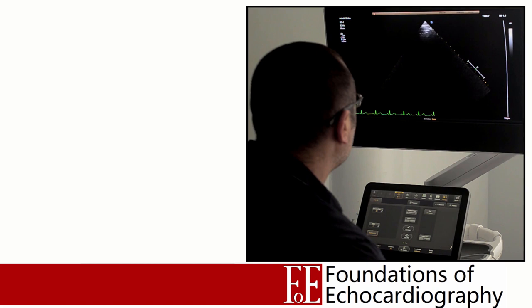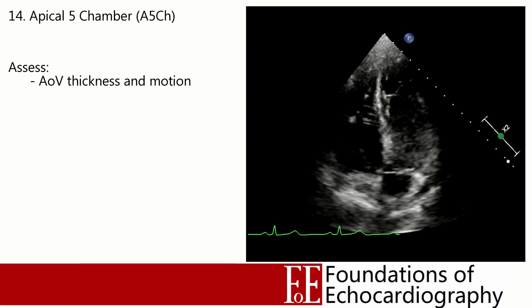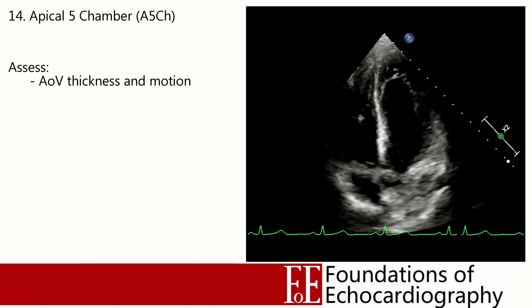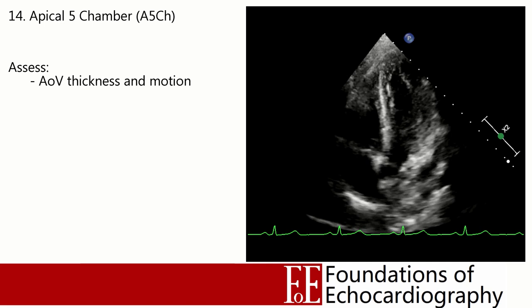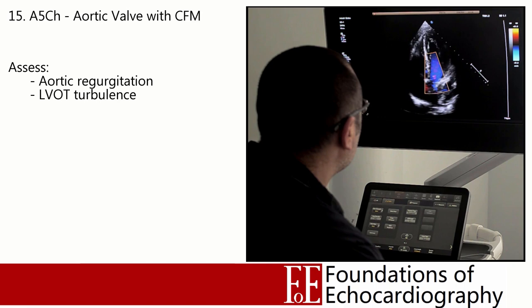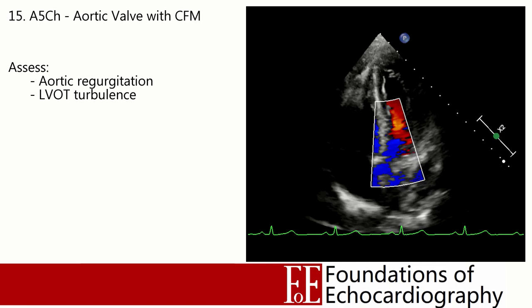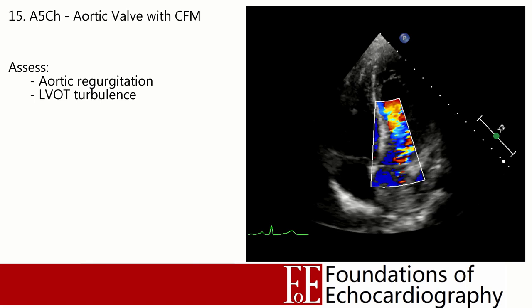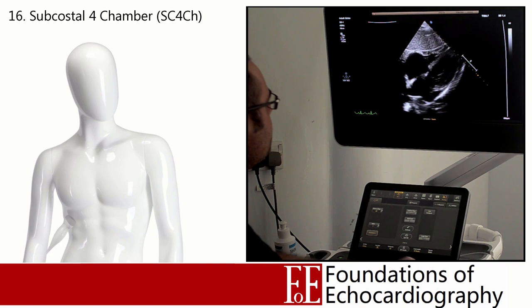Without moving the probe, go back to the apical four chamber view and convert it to an apical five chamber view by tilting the probe to see more anteriorly — lowering the body of the probe. This reveals the left ventricular outflow tract and the aortic valve, sitting anterior to the mitral valve. While we inspect the aortic valve, the principal reason for this view is to place a colour box over the LVOT and aortic valve, looking for turbulent flow within the outflow tract and regurgitation back into the left ventricle.